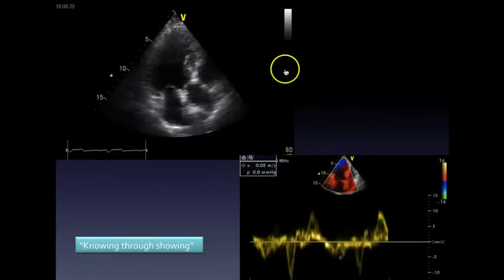Again, you get a nice systolic excursion. So for a 78-year-old man, with tissue velocities up at about 9 centimeters per second, I'm confident his pump is not the problem, at least the systolic portion of it. And in fact, his diastology is pretty good too. If you want to get into diastology, you can see effectively the tissue Doppler equivalent of the A wave reversal, which indicates that his diastology isn't too bad either.